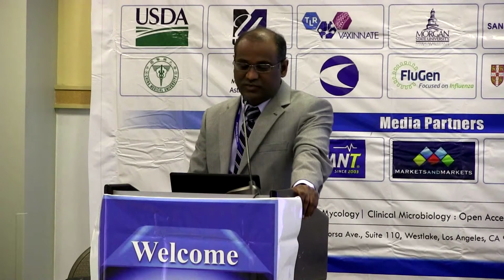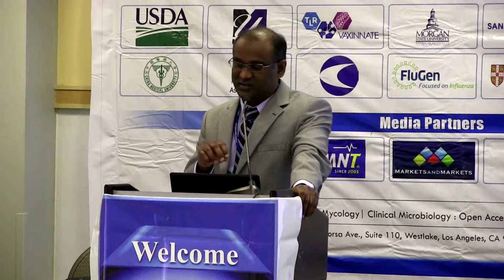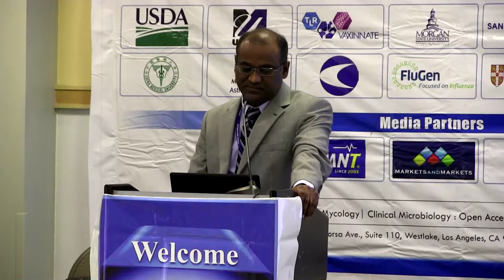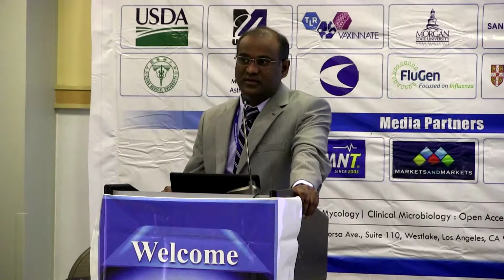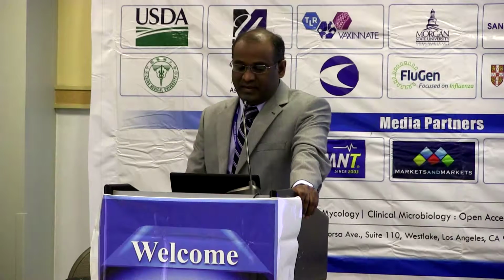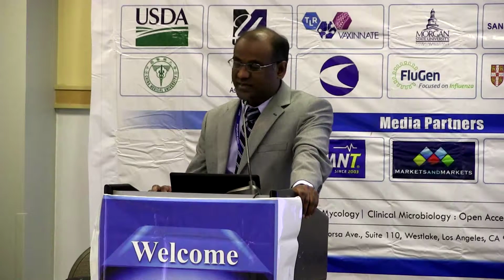So slowly, these tube cultures are being phased out, and now we have these shell vial systems. These are tubes with cells grown on a cover slip. The virus is inoculated, and within a day or 2, you detect the virus with fluorescent antibodies. These shell vials are called co-cultured cells, and they seem to synergistically improve the yield of the virus or the detection rapidity. So the R-mix, which is a mixture of A549 plus mink lung, and the R-mix 2, which is A549 plus MDCK cells, both seem to improve the detection rate and the speed at which you can diagnose these infections.